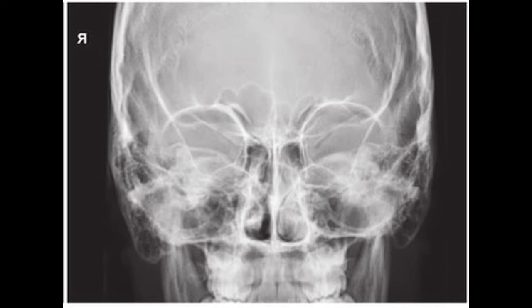There's no rotation or tilt, and I can tell that by double checking that the lateral border of the skull and the lateral border of the orbits are equidistant, and the petrous ridges are symmetric on both sides of her head. And the mid-sagittal plane was aligned with the long axis of my collimated field, and I can tell that by looking here at this image.